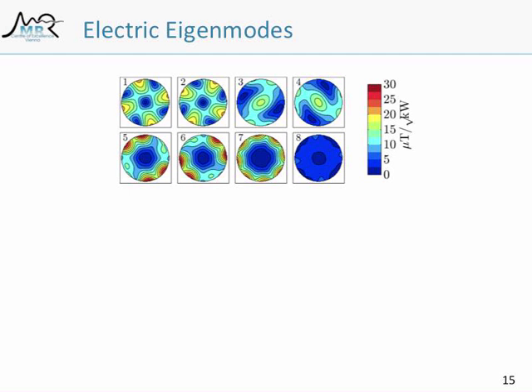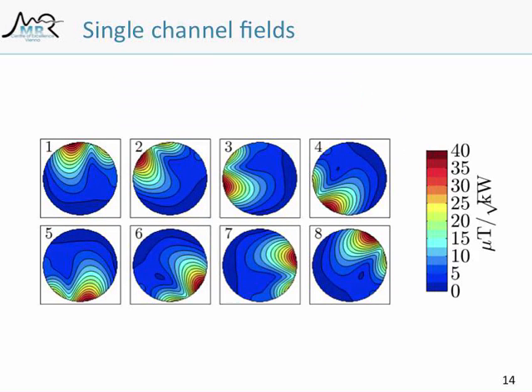And what is really helpful when looking at an array is not the perspective of the single channel B1 maps. I mean, everyone sees those in their solver. You can have a look at the single channel B1 maps, but that doesn't really tell you anything about how your array performs globally over your whole sample.